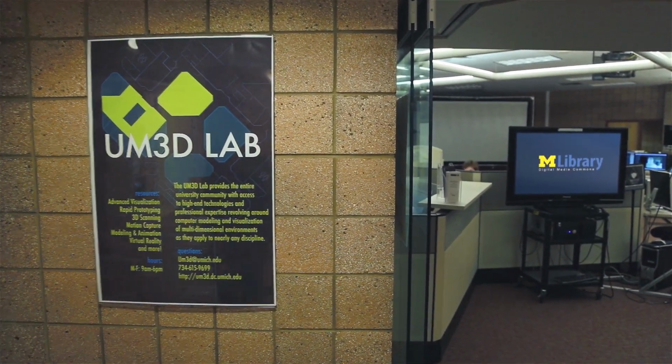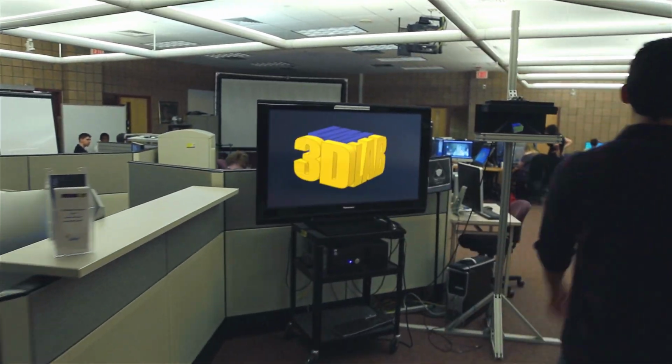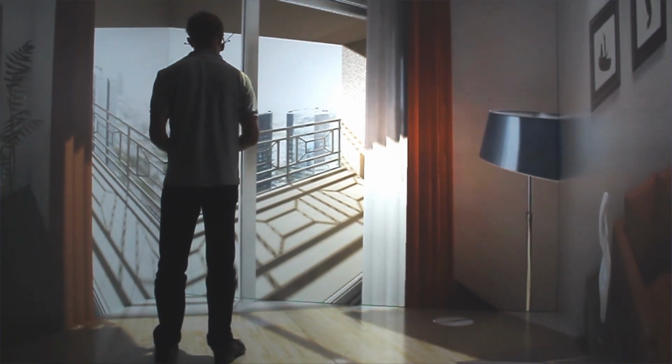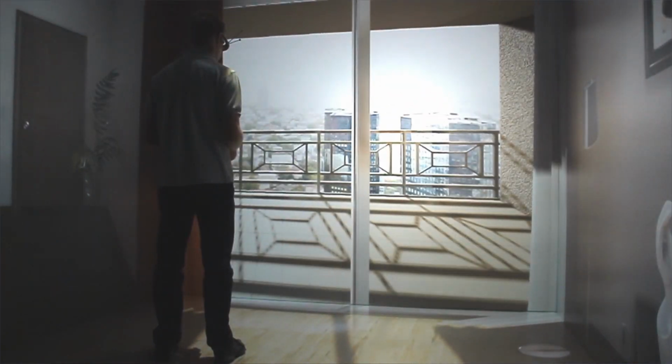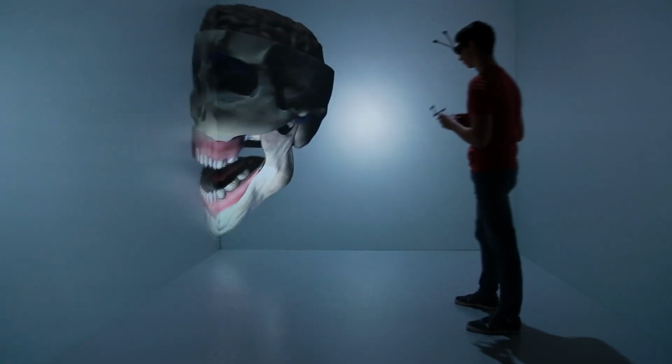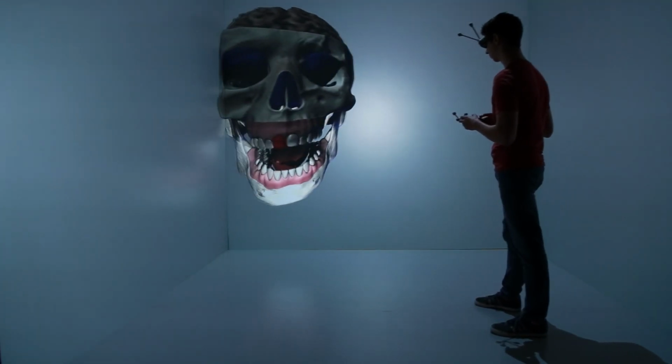So the first time I came to the 3D lab, I was introduced to MyDen, which is a virtual reality room or space. And I decided, well, having a skull in front of you and moving around this object and manipulating the skull might be a very important way for students to learn.